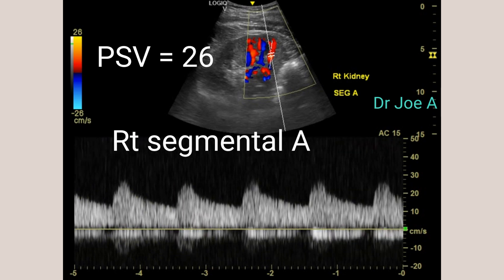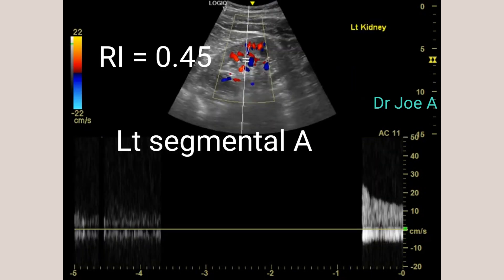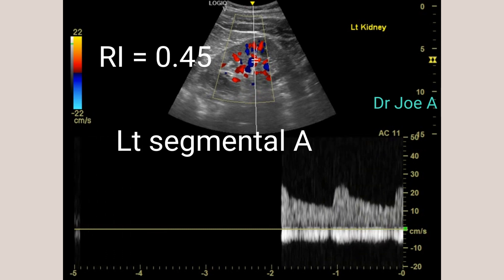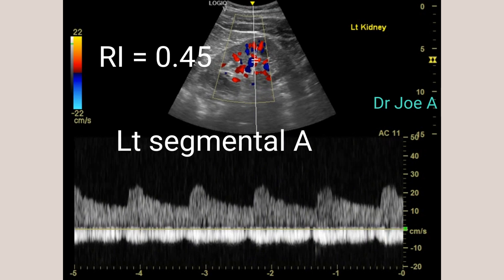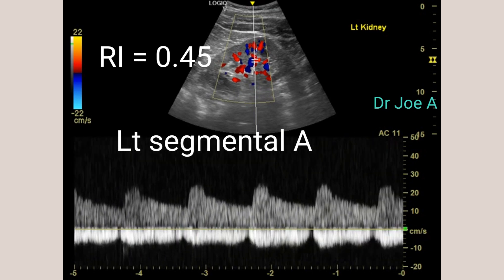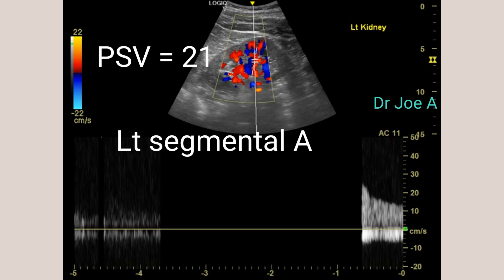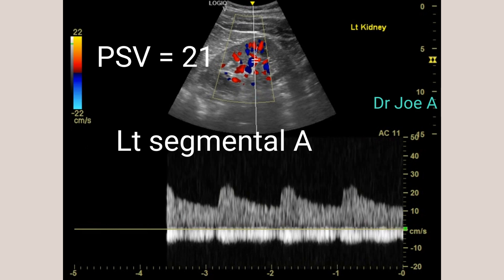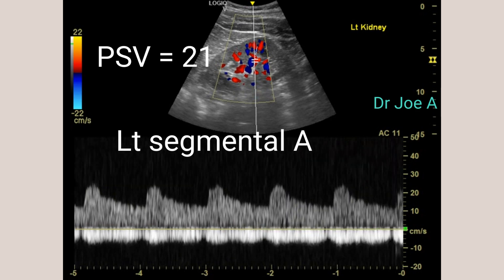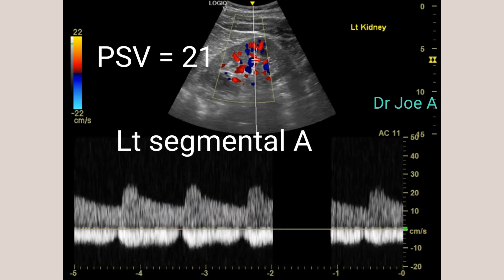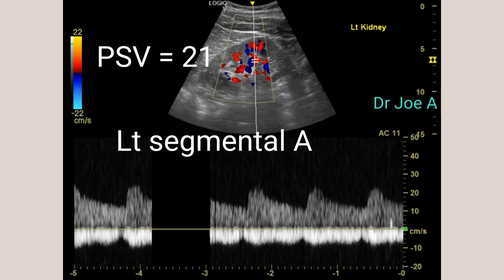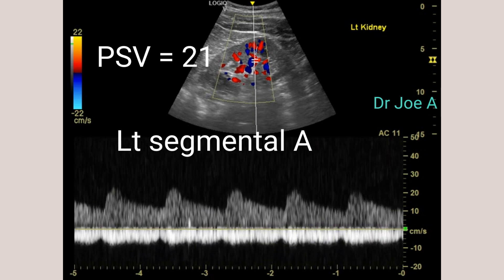The systolic upstroke in the renal arteries is sharp and well defined. The second part of the diastolic phase shows a rapid deceleration during diastole, resulting in a distinct diastolic phase with continuous flow during diastole. The third phase is the end-diastolic phase, which occurs just before the start of the next systolic phase and is the last component of the waveform, represented by a small positive deflection. The end-diastolic phase represents the lowest velocity of blood flow during the cardiac cycle in the renal arteries.